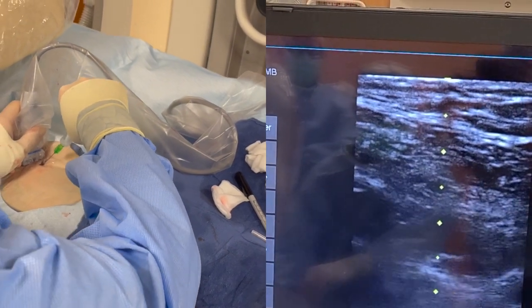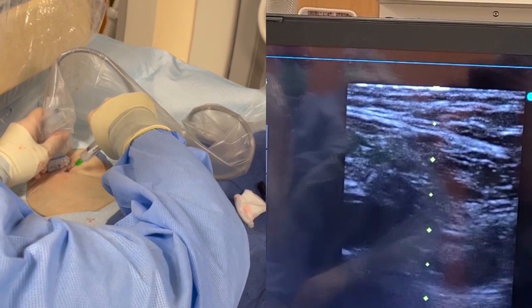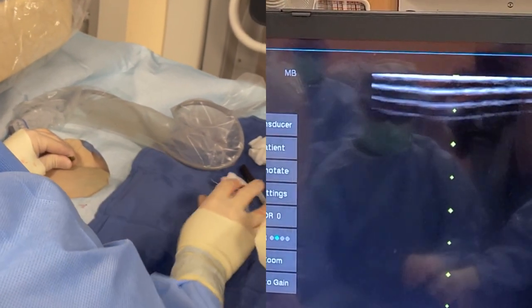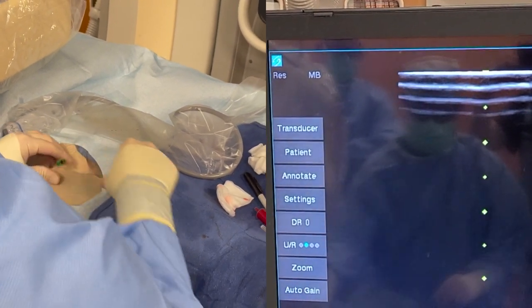With the needle at about 45 degrees and directed toward the vein, I can see I'm tenting the vein with the needle, and then I advance until I enter the lumen of the vein. Sometimes you need to come back a little bit on the needle if you've gone to the back wall of the vein.